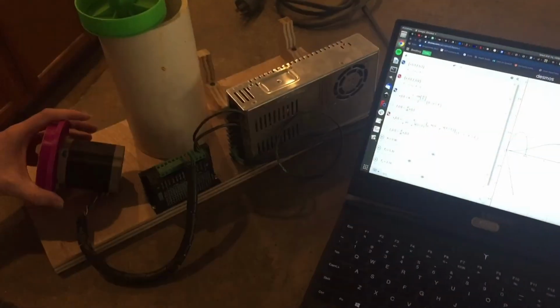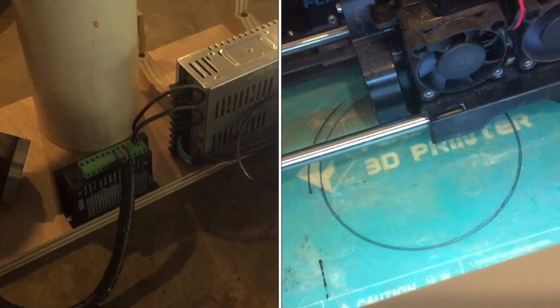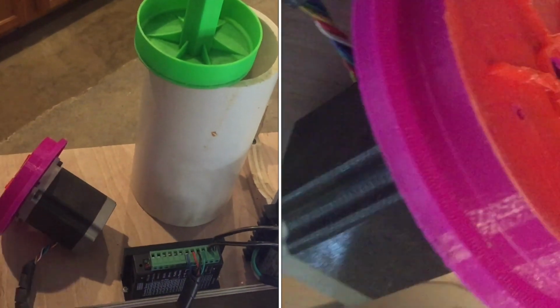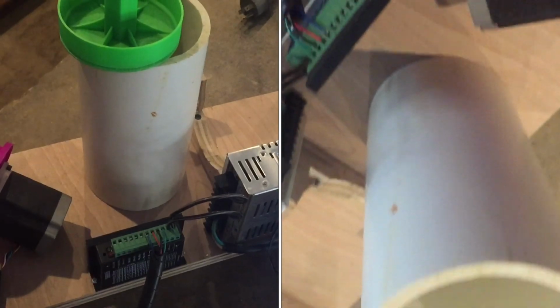So eventually we'll need to program the stepper motor to precisely control our flow rates and volumes and everything, and this model will help us to get that.